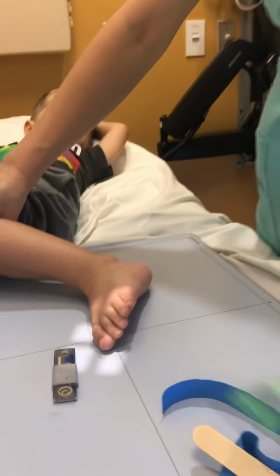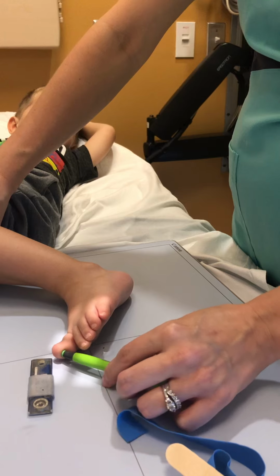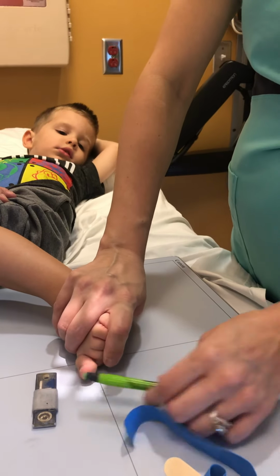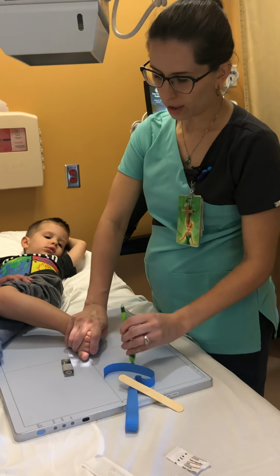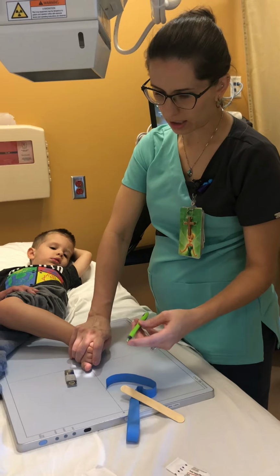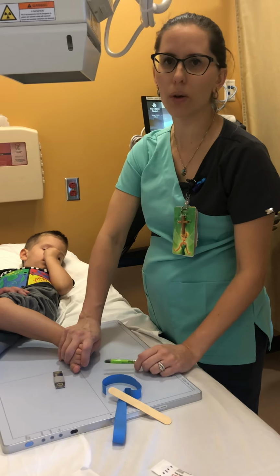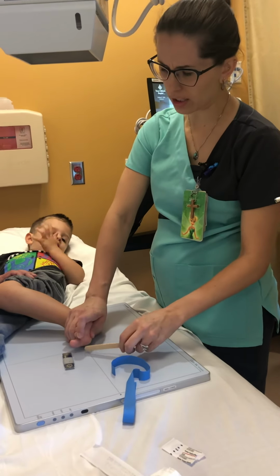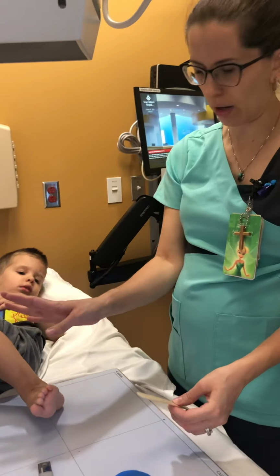A lot of people would say, oh, I'm going to use my pen and push that out. Well, that's all fine and good, but number one, it doesn't separate these toes here. But then two, you can get some artifact, or even some people forget to retract the ink stylet, and so they put that on the foot and they're like, oh, well, there's metal in their toe. Well, it's just from the pen. So I don't like to use pens. I like to use, again, tongue blades. I've used syringes because that's what I had, the little plunger part, putting it on the toe, pushing them out.